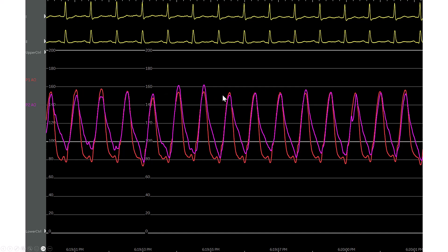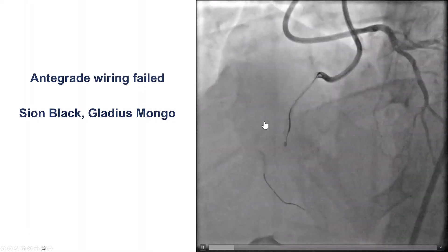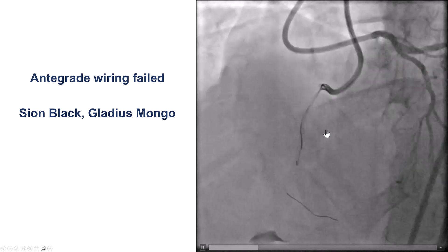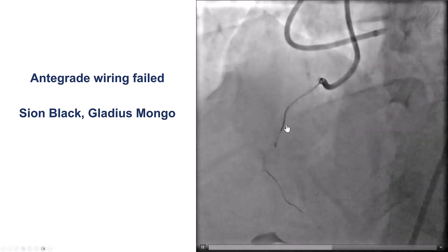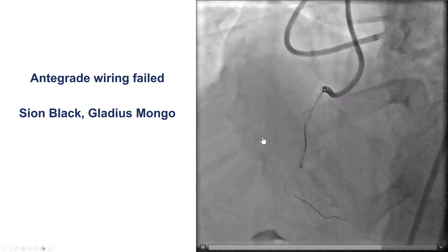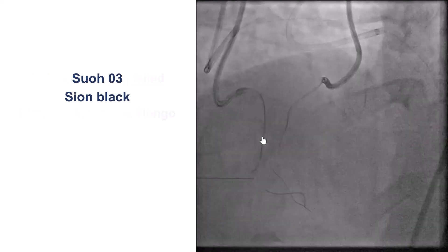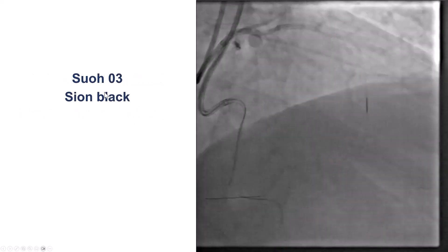The patient's hemodynamics were good at baseline with a systolic of 150-160 mmHg. We tried antegrade wiring, but we were unable to advance a wire past the proximal cap, and as a result we decided to try retrograde.